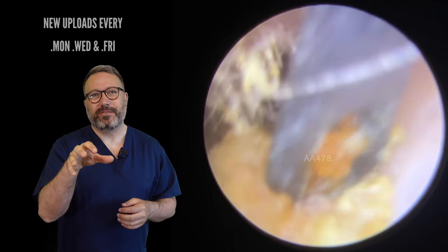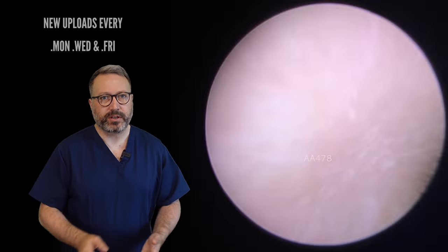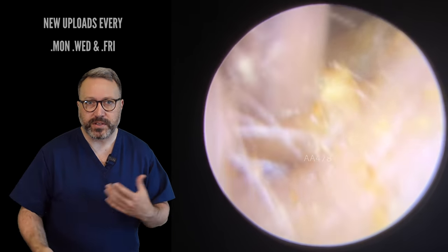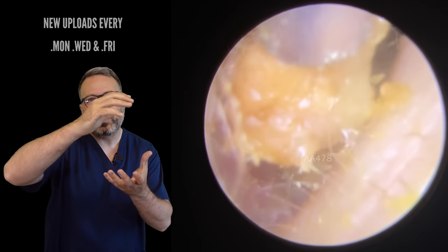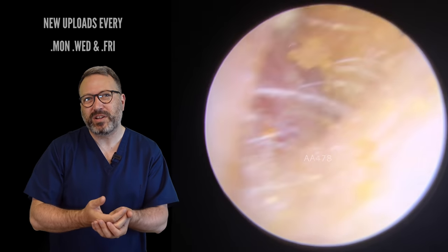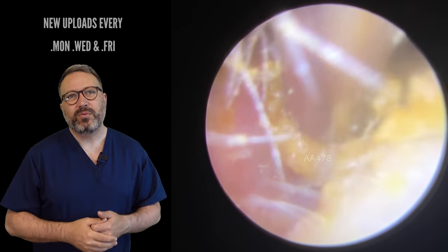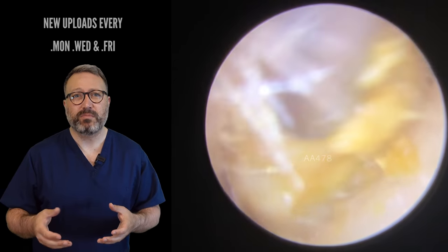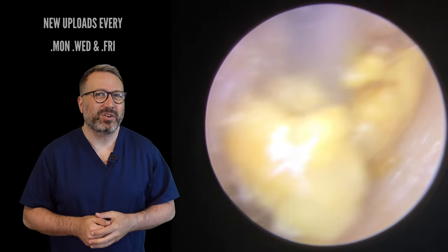We've used other tools here — things like the Sarah scoop, the infant scoop, the flex loop. For this particular type of wax, the scoops — so the infant and Sarah scoop — wouldn't really be much use. They wouldn't have the force to pull it forward because of that rounded edge. This is where the Jobson horn is correct. We could possibly use the flex loop for this one as well, but the narrowness of the outside edge of the canal makes the Jobson horn a better size to go in here.